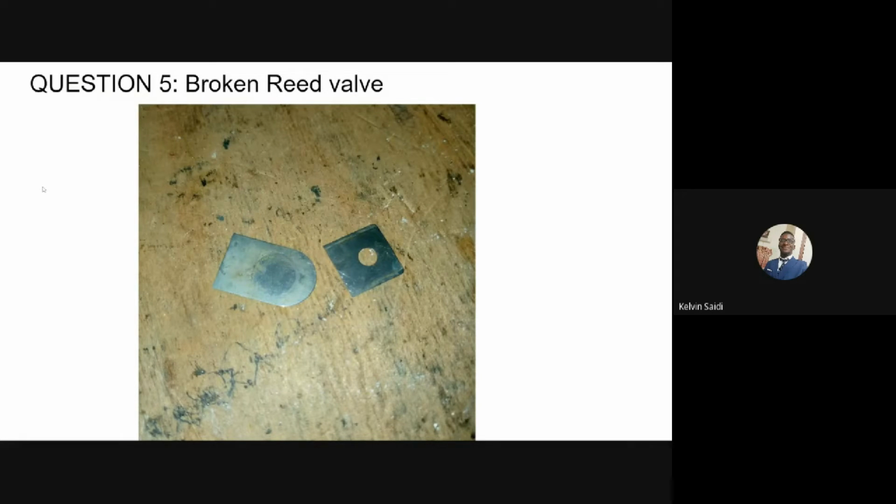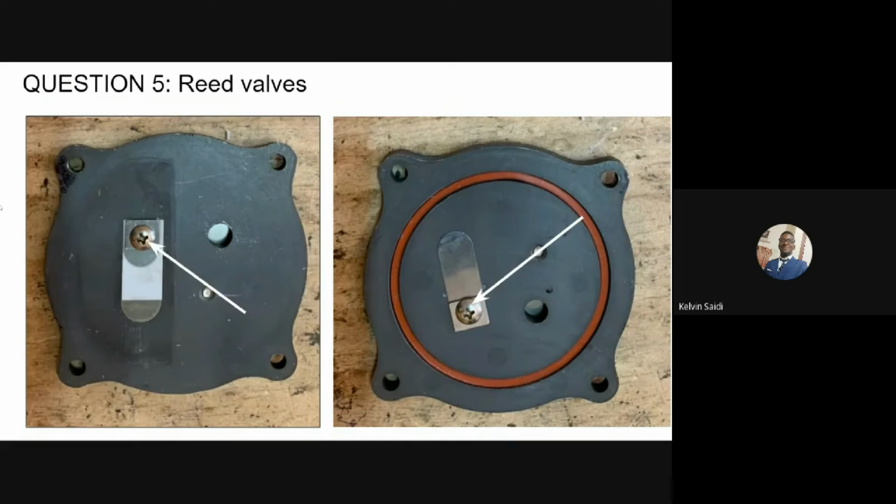After that, remove the screw holding the compressor reed valves in position and the valve plate, and discard the used flapper valves. Now position the new flapper valves so that they are centered and completely cover the holes in the valve plate. The last thing you do is to place the metal retainer on the reed valves and secure it with the reed valve screw. And then finally, you can close up your compressor and test it to see how it is performing.